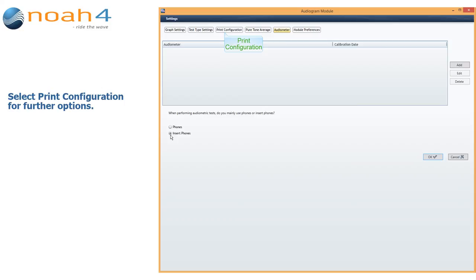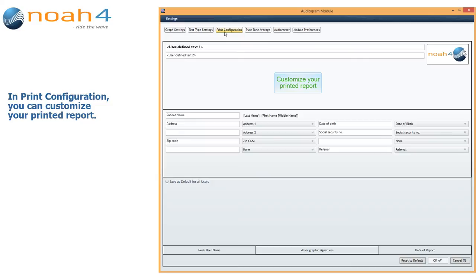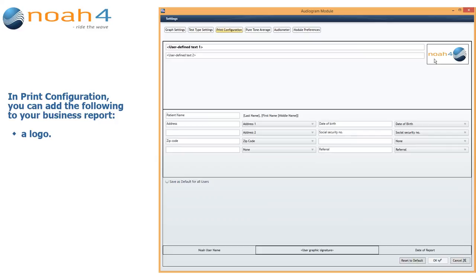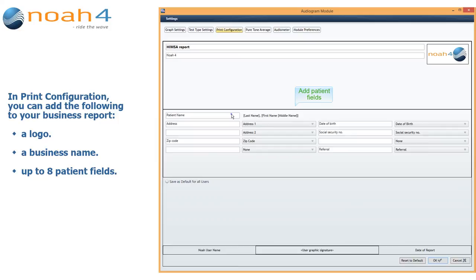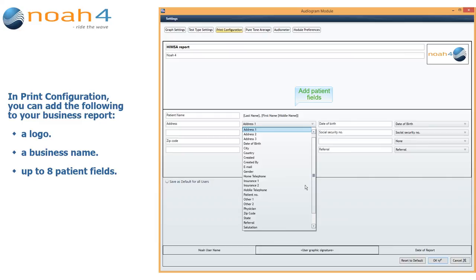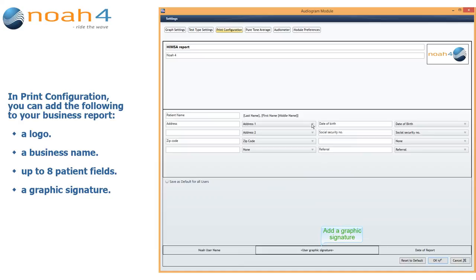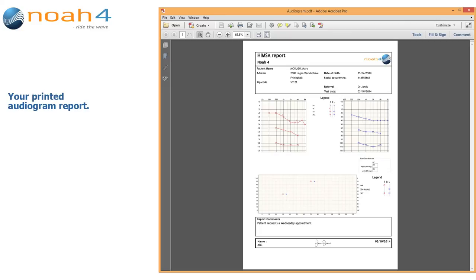Select Print Configuration for further options. In Print Configuration, you can customize your printed report. You can add the following to your business report: a business logo, a business name, up to 8 patient fields, and a graphic signature. Your printed audiogram report will then include these additions.